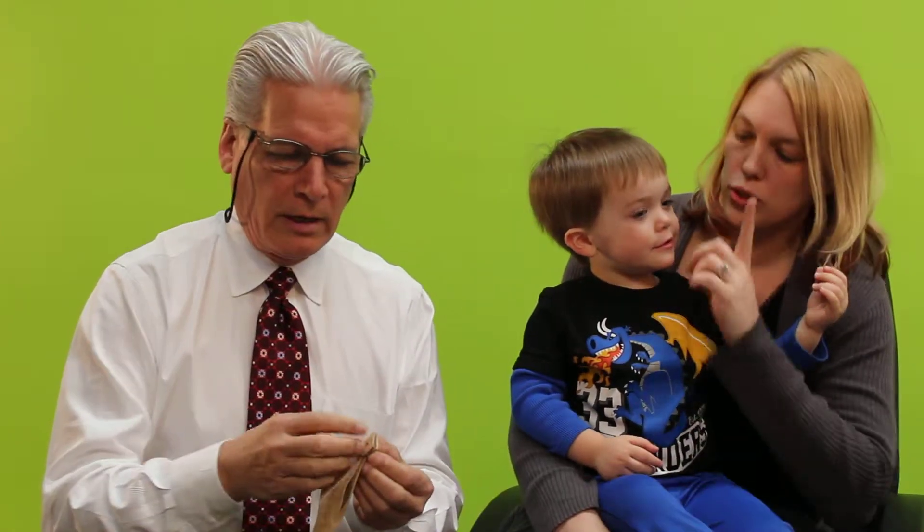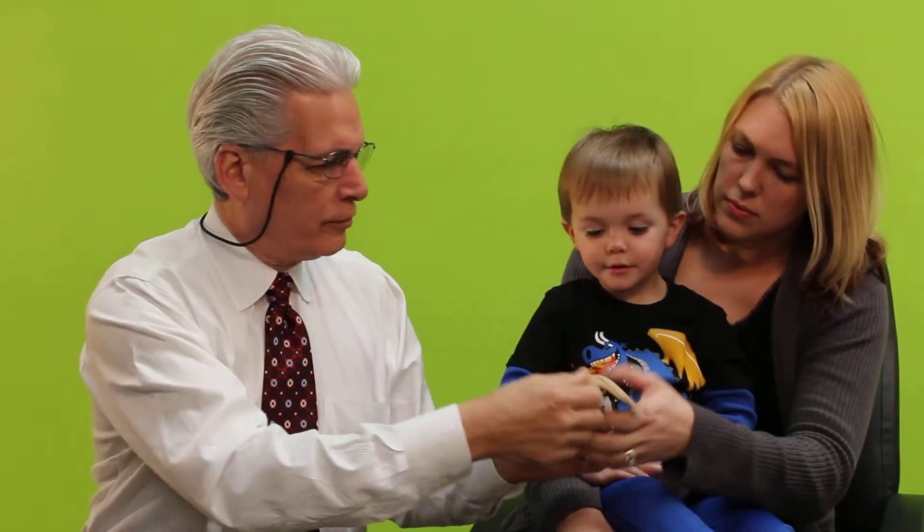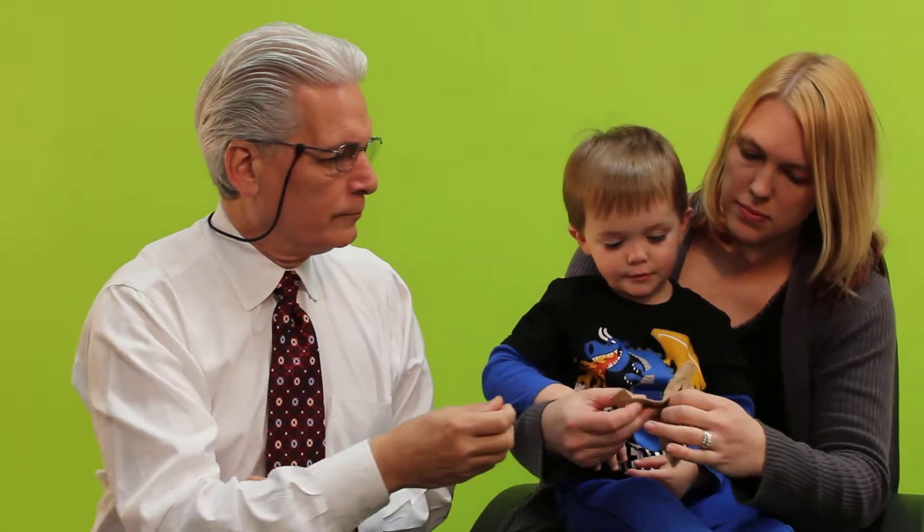Here's a simple look at how to put the hand aid on your child. First, just open the closure and separate the wristband of the hand aid. Place the hand aid over the thumb and pull it down as far as it will go. You want the band to wrap around the smallest part of the wrist. Once you know what size it needs to be, push that closure through the hole.